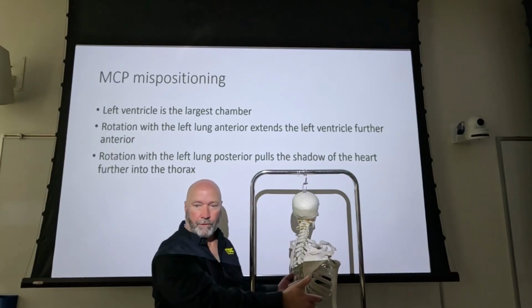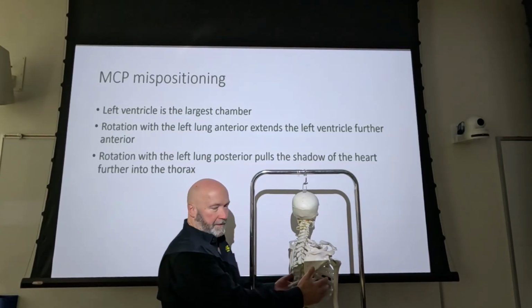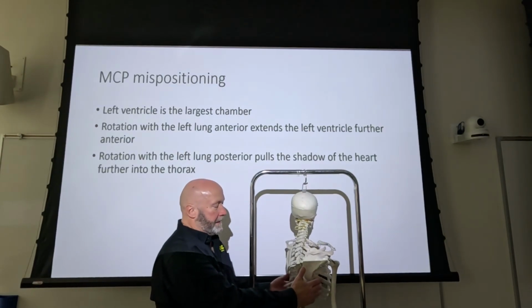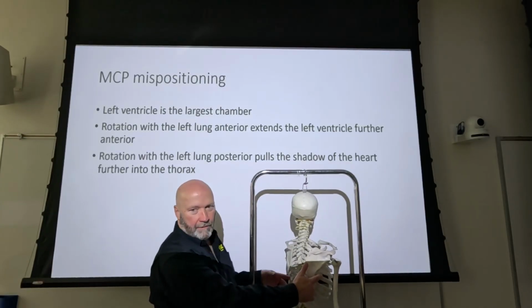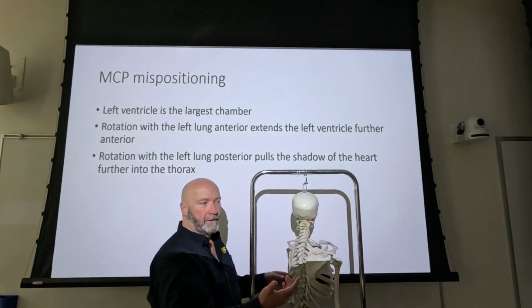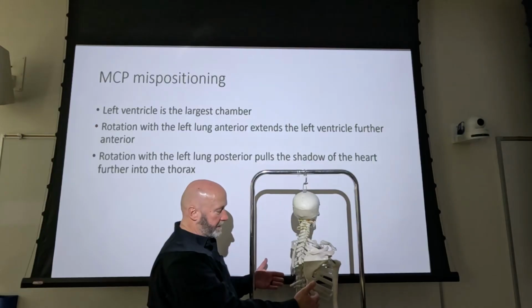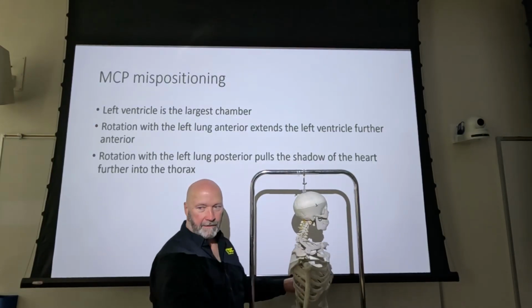So that's your rotation. What you would do is go back in and repeat that, providing the rotation was significant enough that you would need to repeat it. And remember that as you rotate, one side's going in one direction and one side's going in the opposite direction. So your tendency on repeats is to look at how awful that rotation is. Well, it must be the patient's got some funky anatomy, so we're going to rotate in the opposite direction.